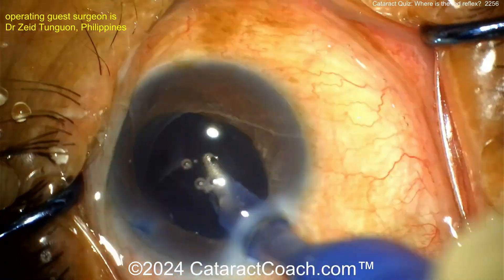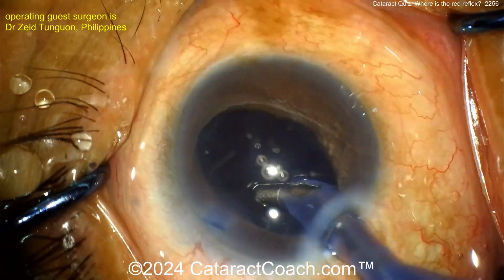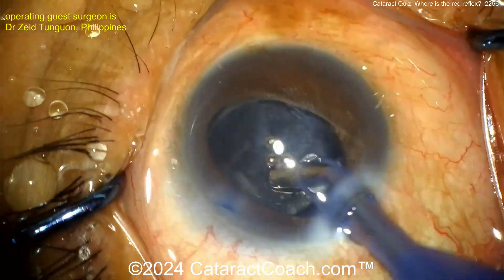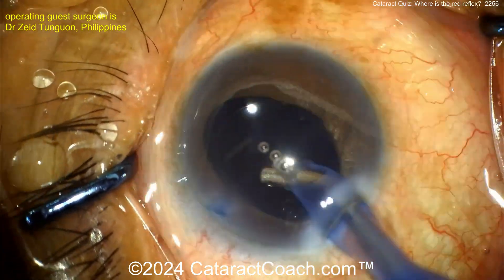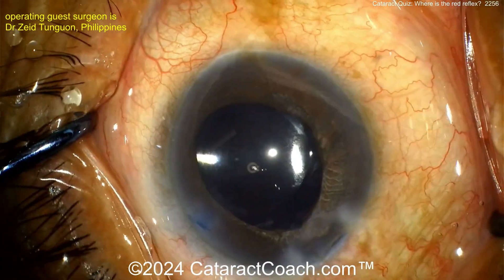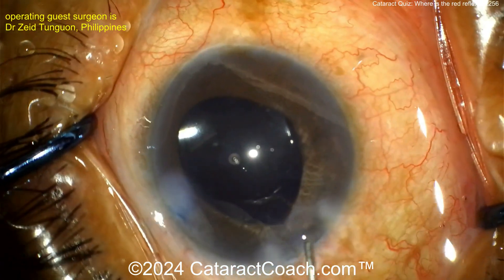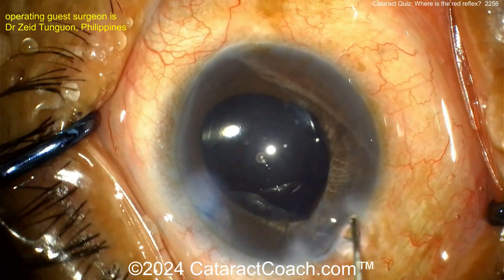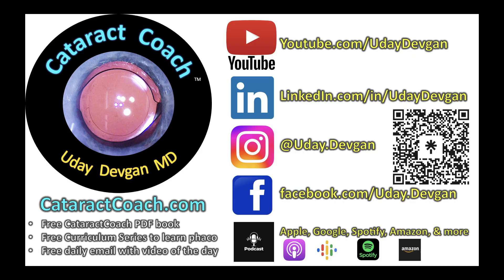For future traumatic cases, consider using an air bubble and putting in just a tiny bit of trypan blue — just enough to paint the anterior lens capsule, instead of doing the big fill. The big fill makes it easy to see, but if there is zonular weakness, it'll go back into the anterior hyaloid and Berger's space. Be cautious in these traumatic white cataracts. Nicely done! New podcast every single week — it's definitely worth your time.